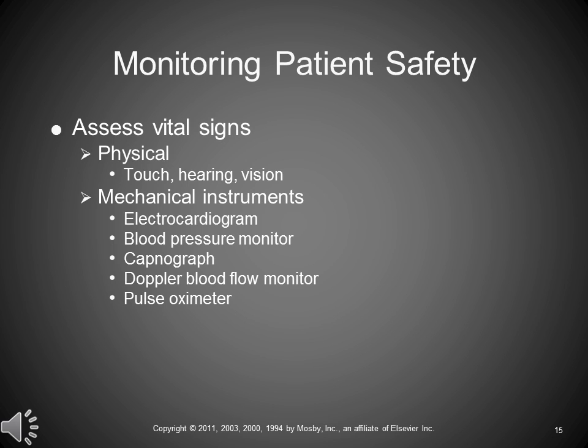We also will use mechanical instruments. You can't fly a plane without the instruments. And they come in real handy. Take them with a grain of salt, but instruments are good. That includes an ECG, a blood pressure monitor, a capnograph, Doppler, pulse oximeter. You probably will not have all of these in your practice, but what you do have, you need to use properly and professionally and diligently.